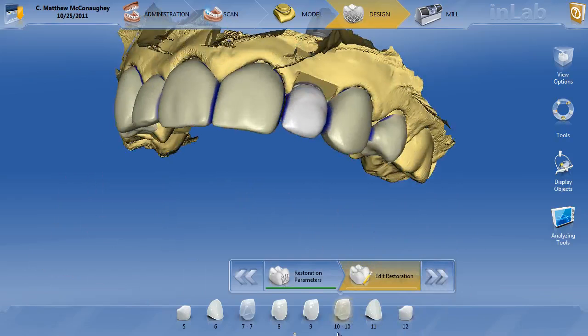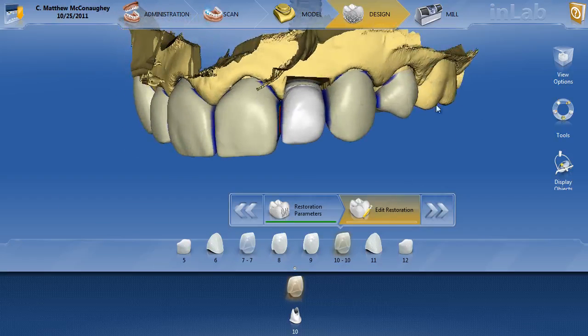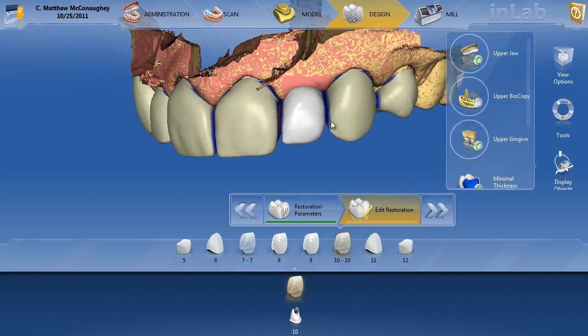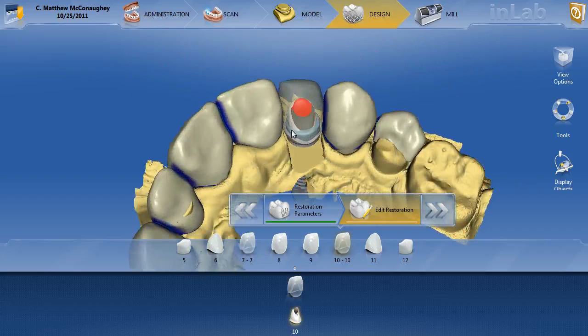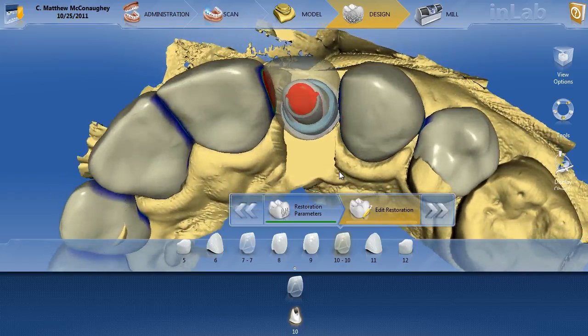When I drop my cursor down, you'll see I have both the overlay, the veneering structure, and the abutment. The veneering structure is what I have in place here. I can certainly turn on my gingiva so you can see where that proposal is in relation to the gingiva — it looks very nice. Let's go ahead and click on the actual abutment. Here is where we have a pretty significant issue on why the dentist wanted to have me take a look at it.